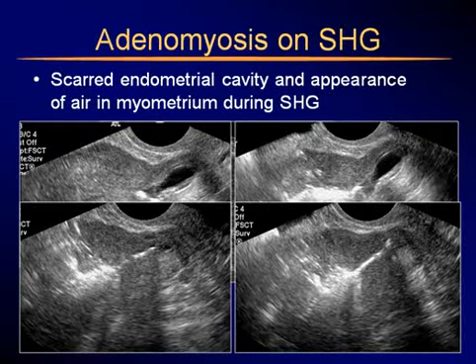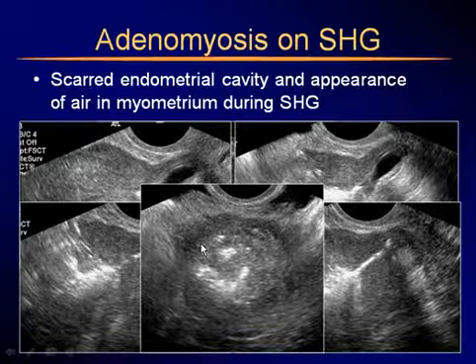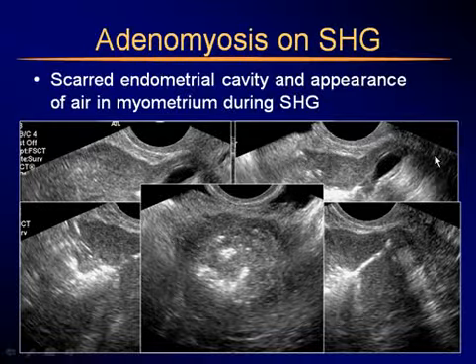and infiltration with adenomyosis. Now, there was no force applied here, absolutely at all. This patient certainly wouldn't have even allowed that. And we have this distribution of air then throughout the myometrium as a sign of adenomyosis, which, by the way, was proven in this case with MRI.